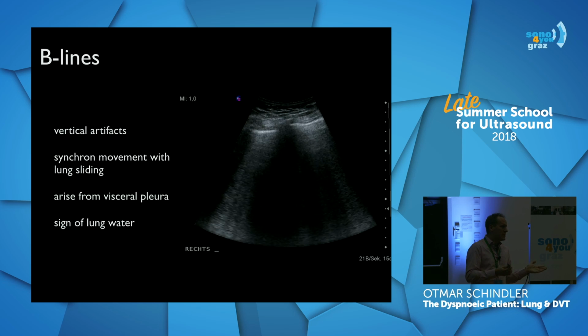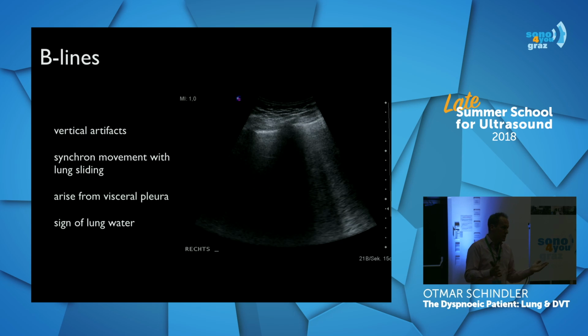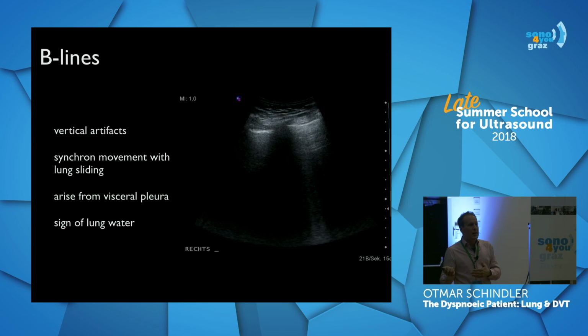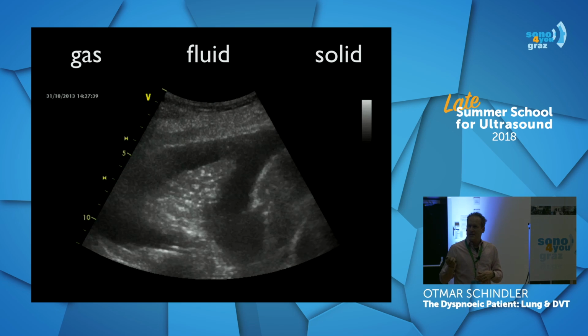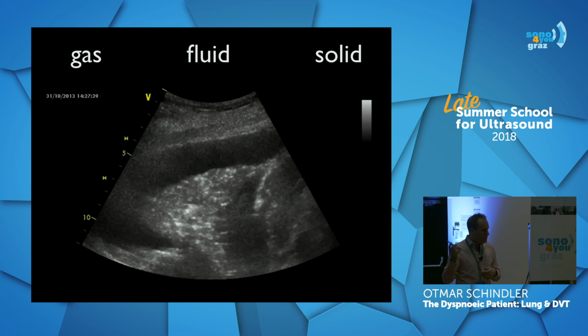And they had the same results. Because the student who did it the first time, after an introduction of 2 hours, just knew how to do it. It's not very difficult. And that's the good thing with the lung ultrasound. It's not so difficult. So we said the problem with the lung is you have gas, fluid, and solid things.